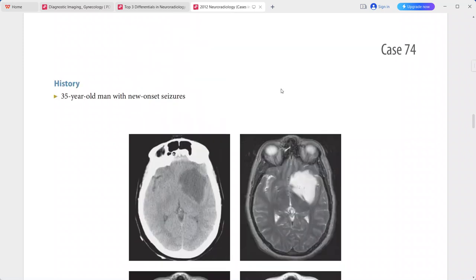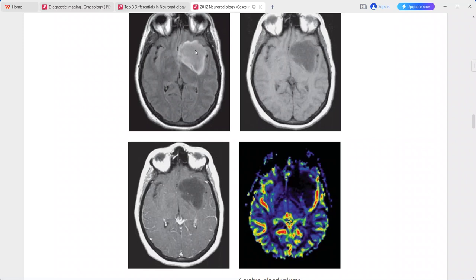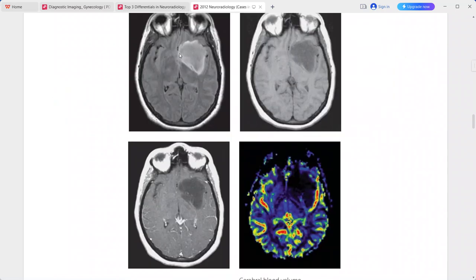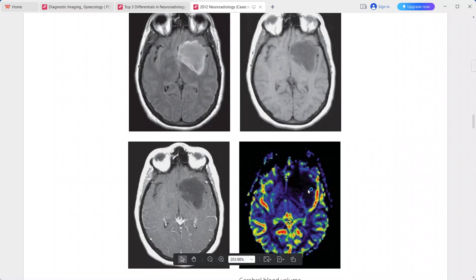The mass is hyperintense on T2 and also hyperintense on FLAIR, although much less hyperintense compared to the T2 signal. There is very little surrounding edema. Perfusion imaging shows decreased cerebral blood volume relative to normal brain.